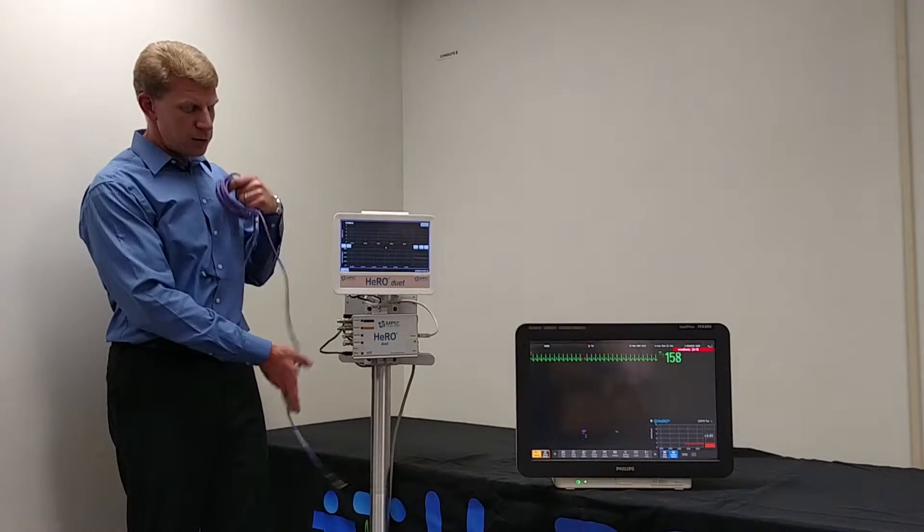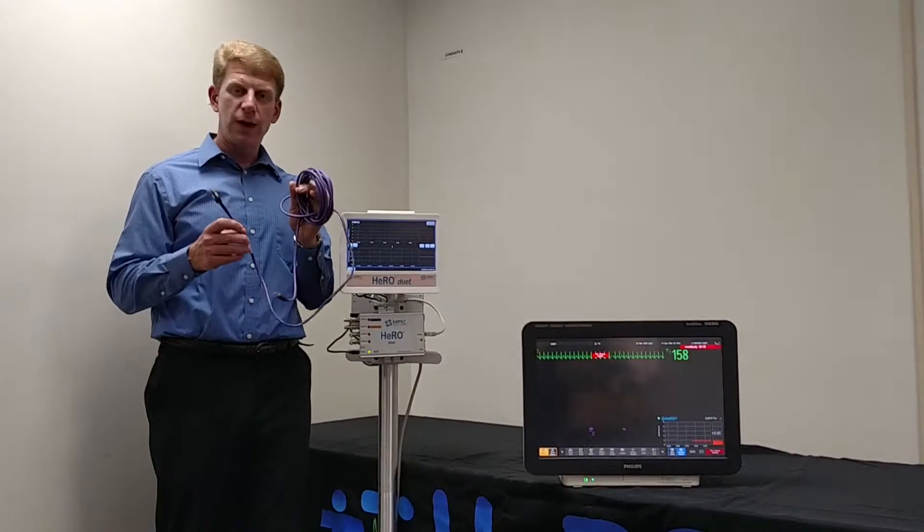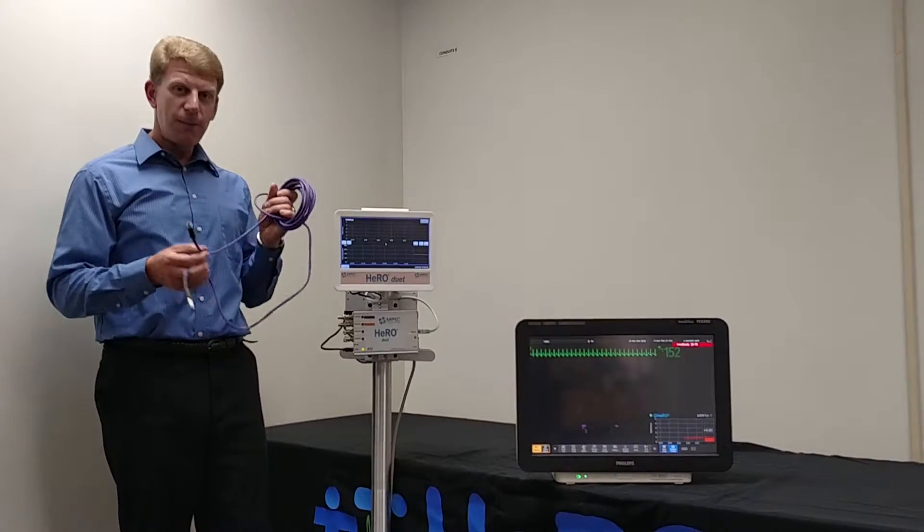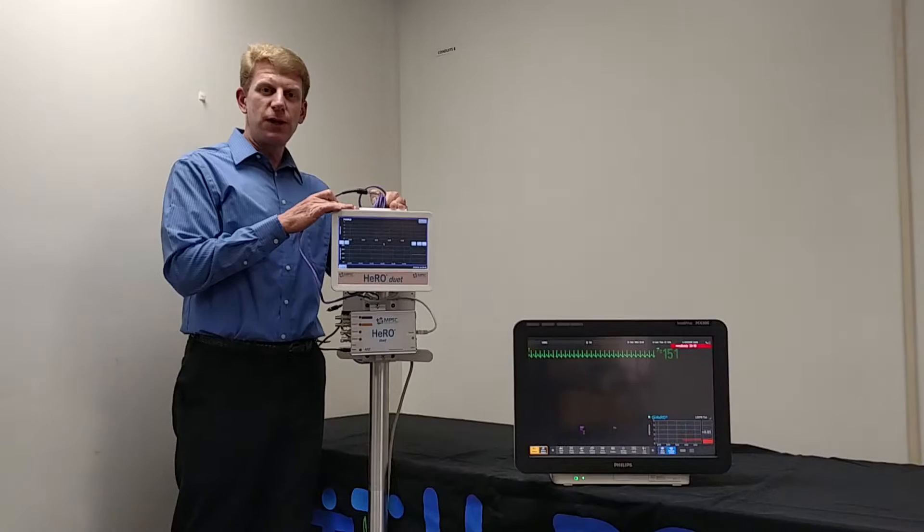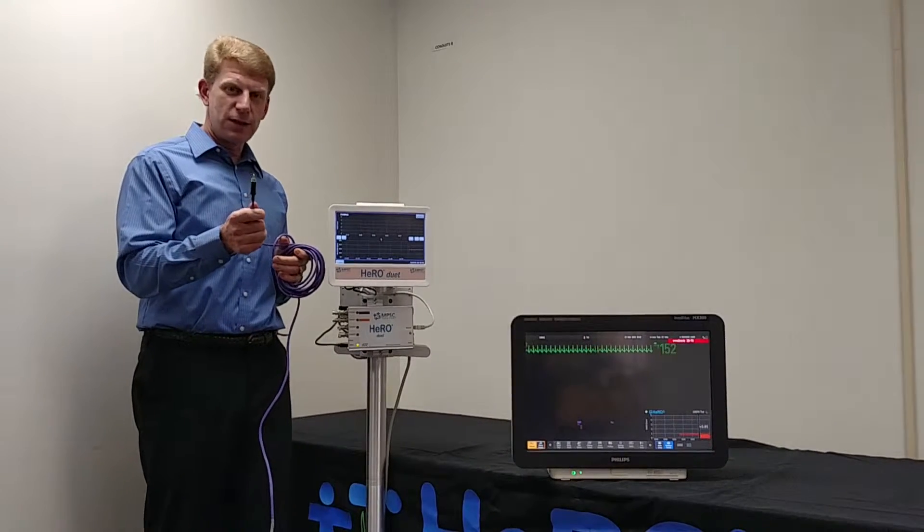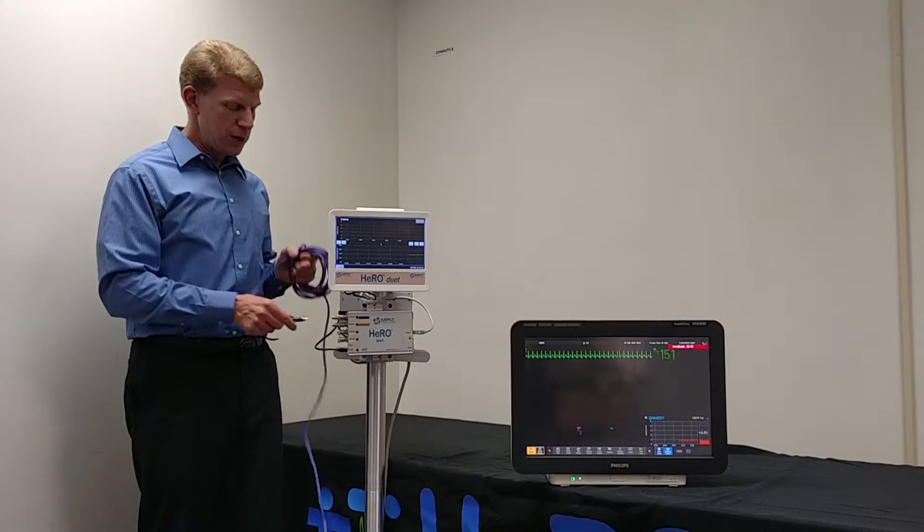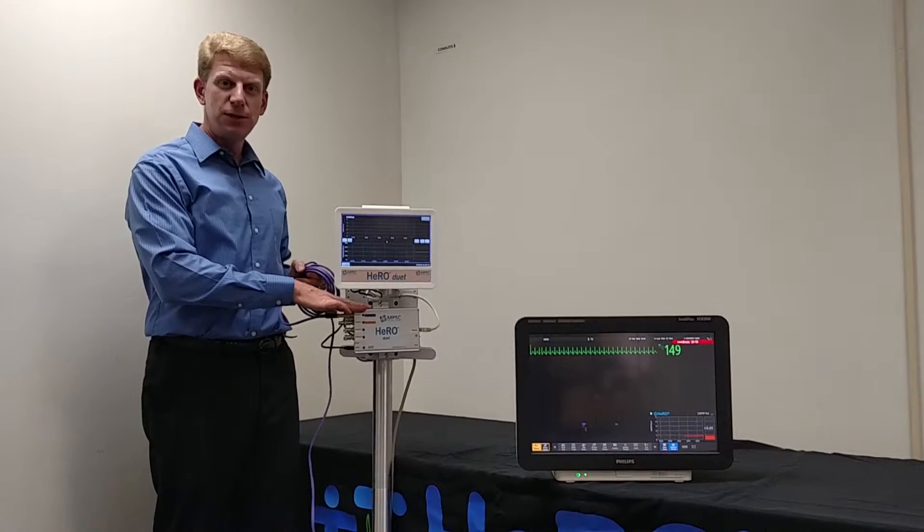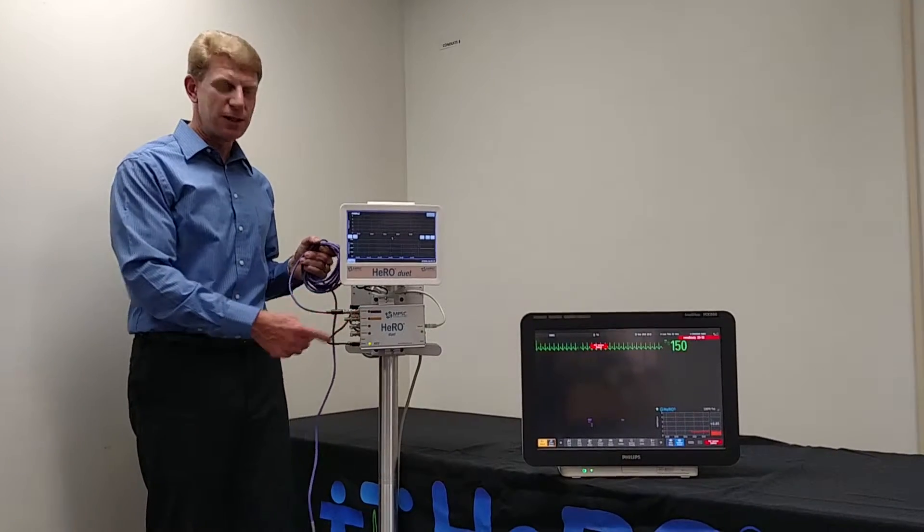For every type of monitor that we are compatible with, we provide special cables for it. This is a purple cable. This is always for your first channel. To hook up the actual Hero Solo or the Hero Duet to the monitor is very simple. There is one end that has an RCA plug, and they'll only go in one way. We plug the purple into the top channel on what we call the 82, which is this box, and there's a purple label associated with that.